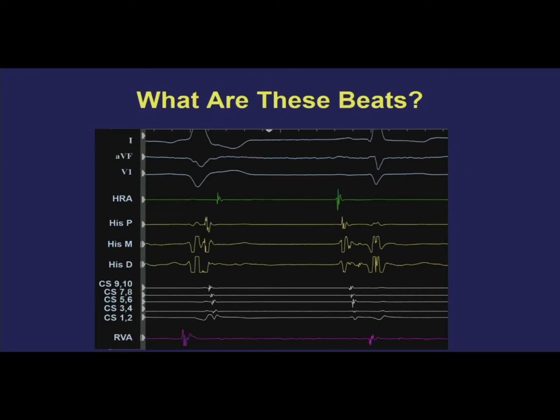How do I know that these are atrial signals and not ventricular signals? Because it sort of lines up with the V, maybe. They're sharp, but, well, I don't know. Maybe I went down a branch of the coronary sinus. Maybe it's advanced out to the great cardiac vein. Same activation sequence and shape as the one on the right?